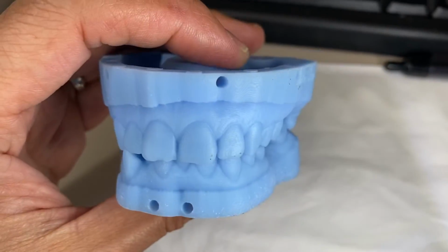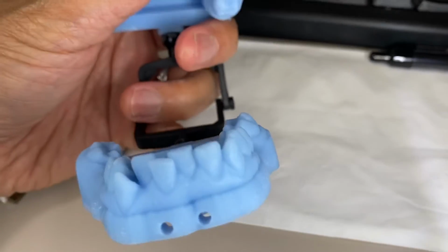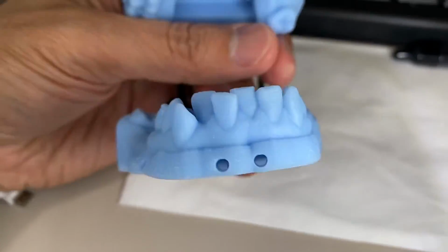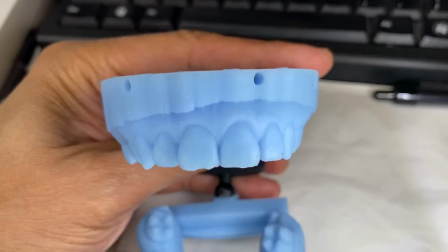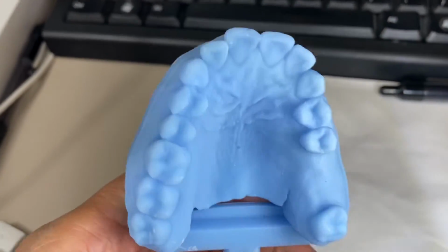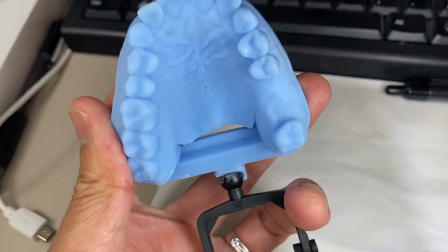Okay, so the patient's chief complaint is that she doesn't like the lower teeth at all, but that's understandable. Her upper teeth look quite straight, but after I printed it out, I showed her that there's more than just a problem with the lower teeth. The upper teeth also have a problem.